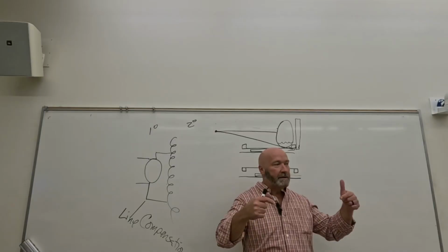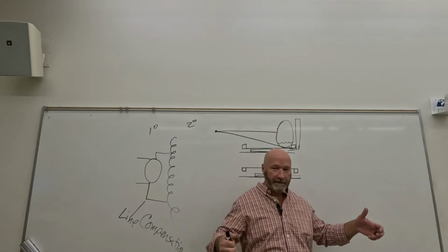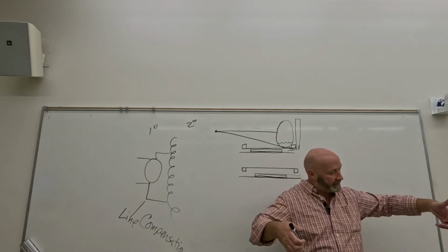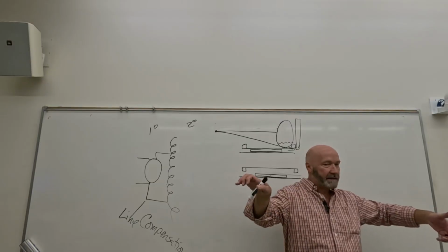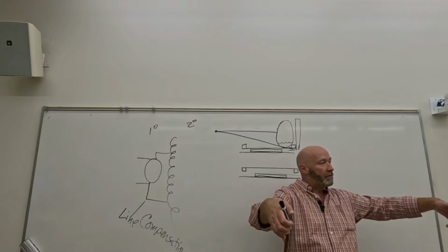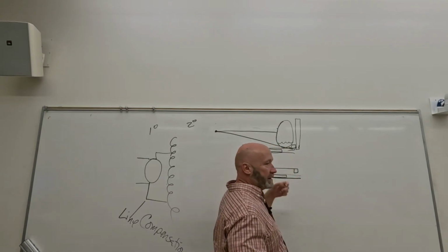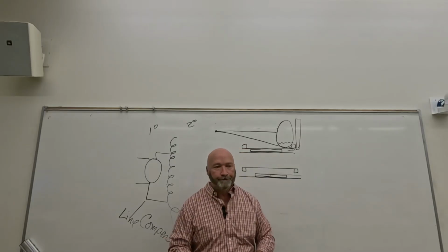That footboard locks into place in specific places. So you need to be familiar with how the footboard goes on. Some of them have one side that is fixed into place. You just latch it on, and the other side pivots out, right? So you put that thing on there, you clamp it down, but it's only going to go into a specific slot in that tabletop. This thing has a big chunk taken out of it where it's going to fix itself, right?